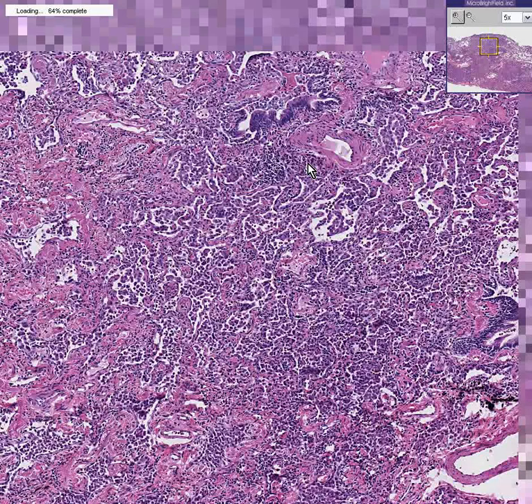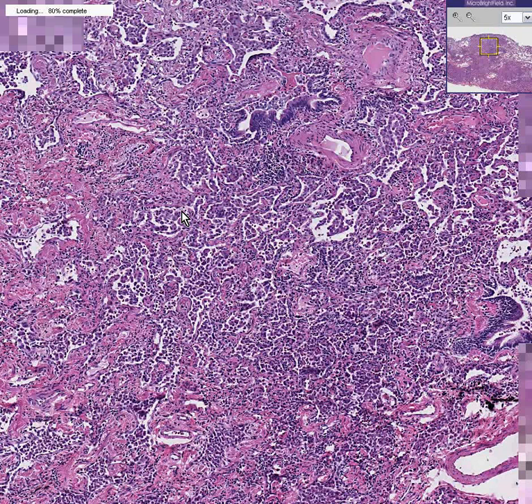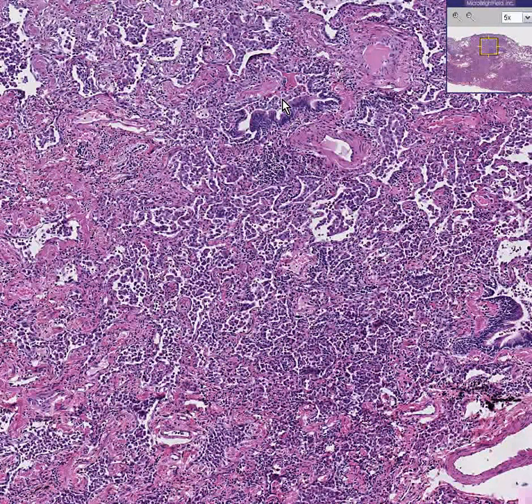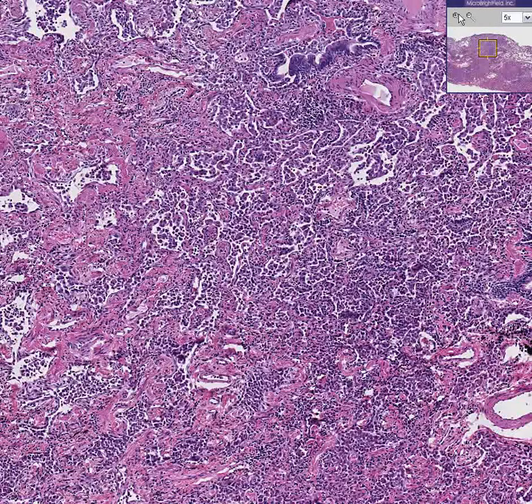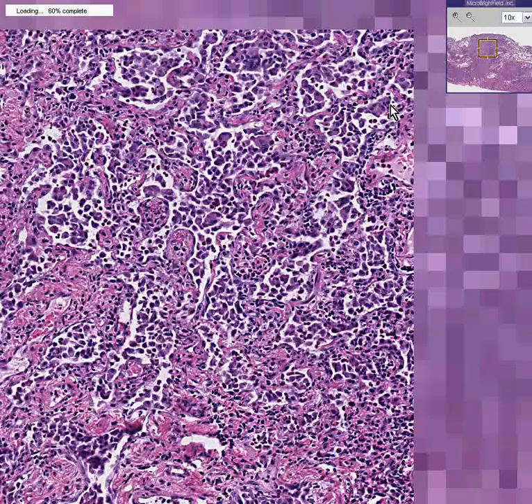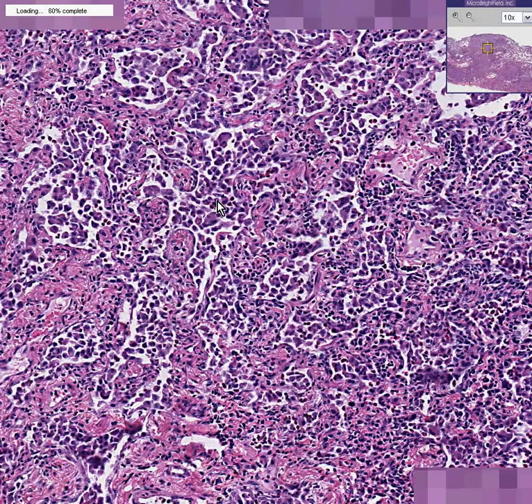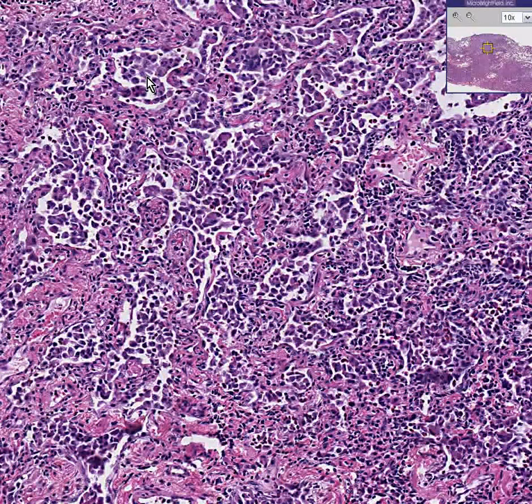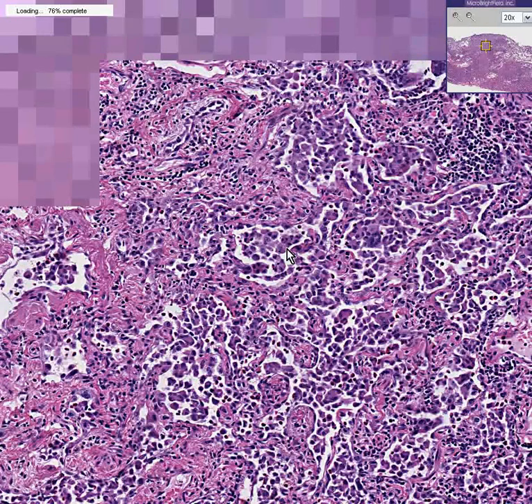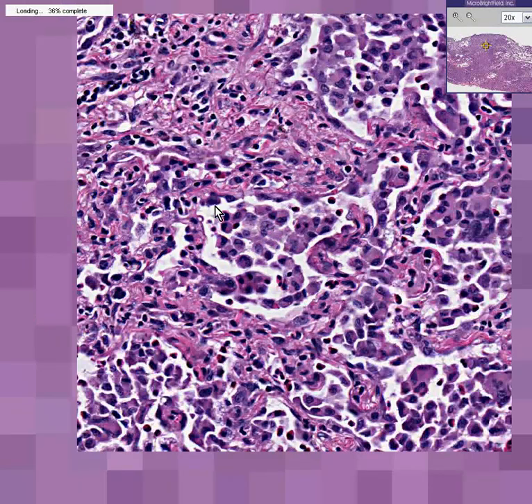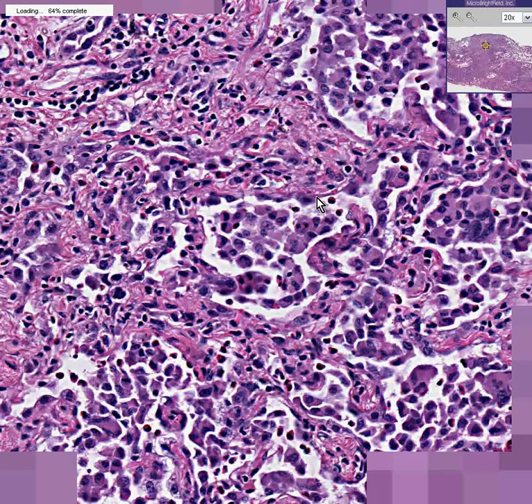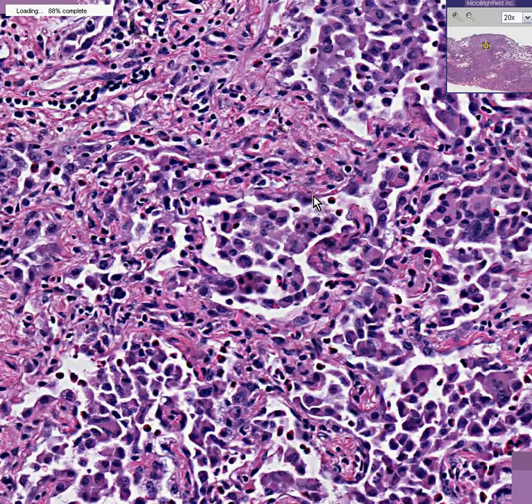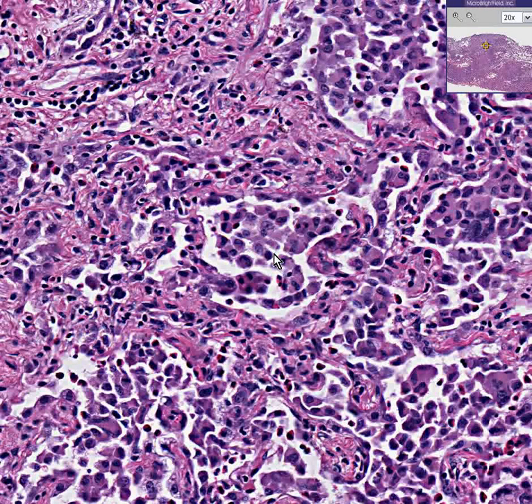Let's see what this junk is and maybe we can make some sense out of this case. Here are the alveoli and here's the junk, and it's in the bronchus as well. You can see that the alveoli are filled with cells — they're not neutrophils, they're not lymphocytes. It almost looks as though the cells that normally line the alveolus actually fell into it, like they were peeled off or desquamated. This is desquamative interstitial pneumonia.